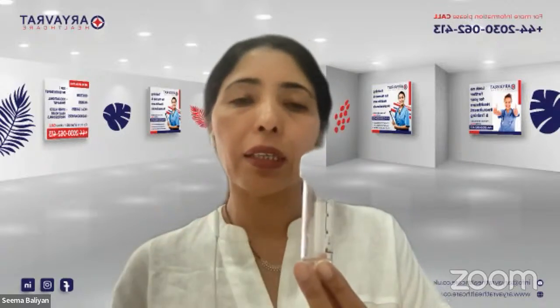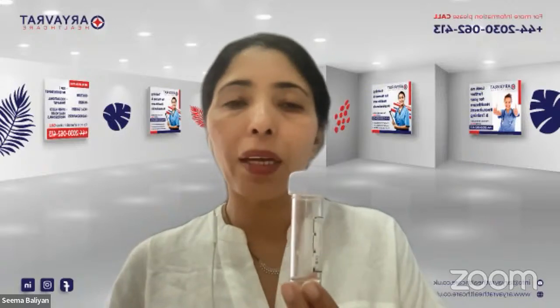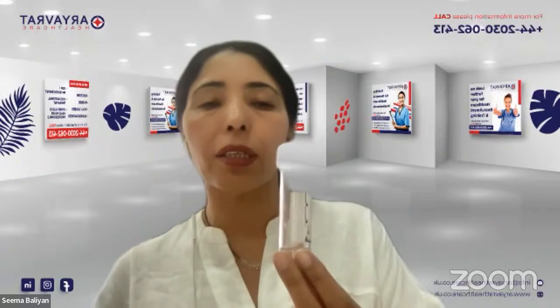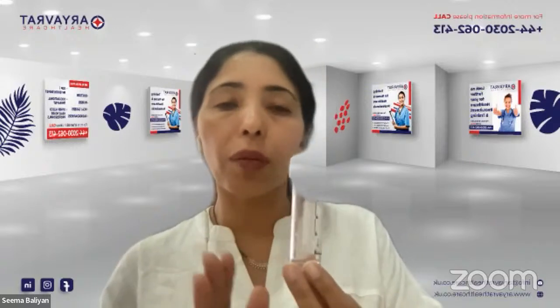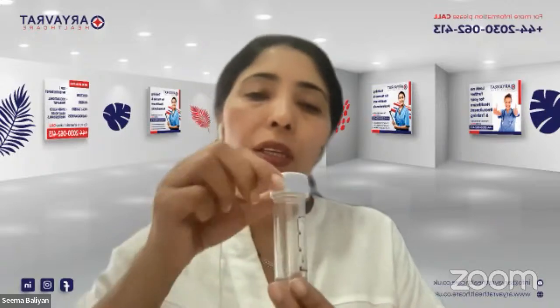So you will say that it is looking, whatever the color is. So normal color is pale yellow or straw colored. So you will mention that I can see that it is pale yellow or straw colored. It is clear. So you are going to tell the clarity, that it is clear. There is no turbidity. There are no signs of any contamination in this one.